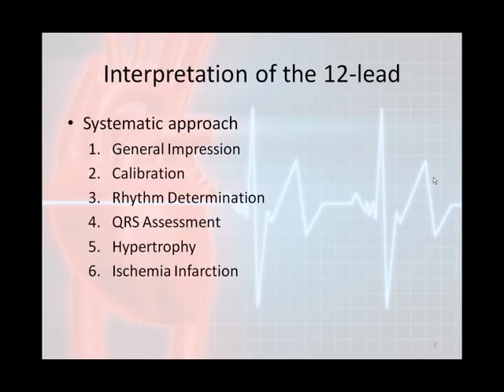The second reason is that not all ST segment changes are indicative of an MI. There are several ACS imitators that can mimic ischemia and infarction. If you follow the 6-step process, you will be able to identify some of these imitators, and that may actually change your overall 12-lead interpretation and possibly your patient treatment plan.